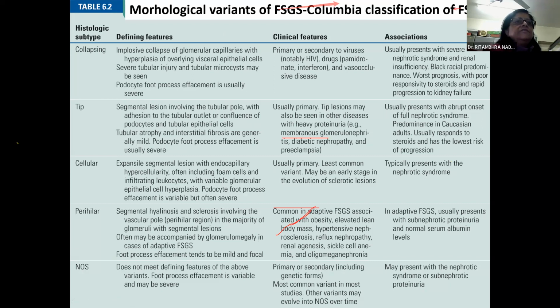Another question relates to consensus on APOL1 FSGS in terms of morphology. To this, the literature says that FSGS due to APOL1 generally has global glomerulosclerosis. Like if you see 10 glomeruli, 2 of them will be completely sclerosed and the rest will be normal. In that scenario, we do mention that this is focal global glomerulosclerosis, and patients should be investigated for APOL1 mutations.